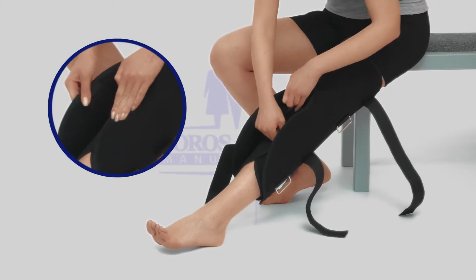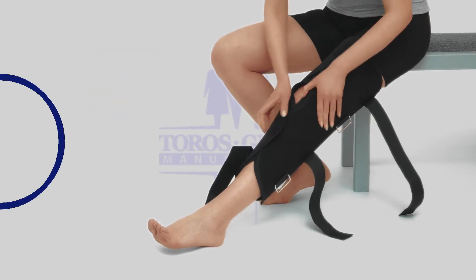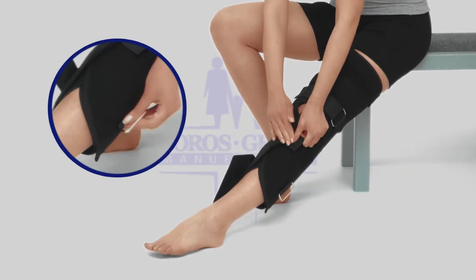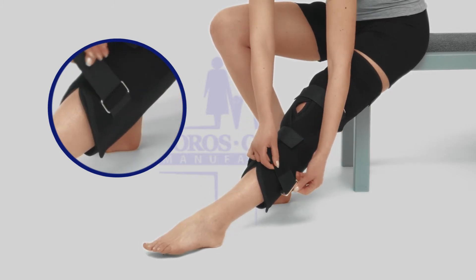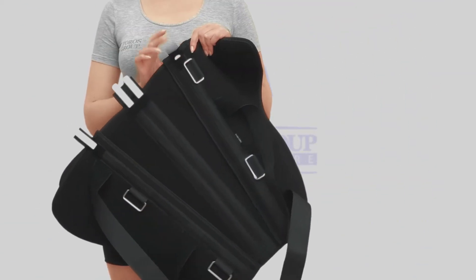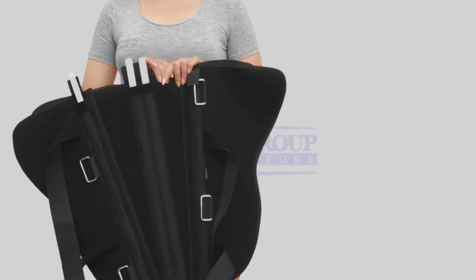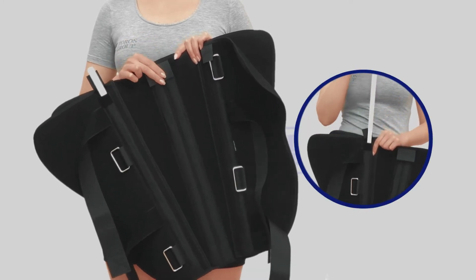The three sections attach to each other using standard hook and loop closures, making this model easy to adjust. The universal immobilizer fits every leg circumference and has been specifically designed to help with temporary immobilization of the knee in a straightened position.